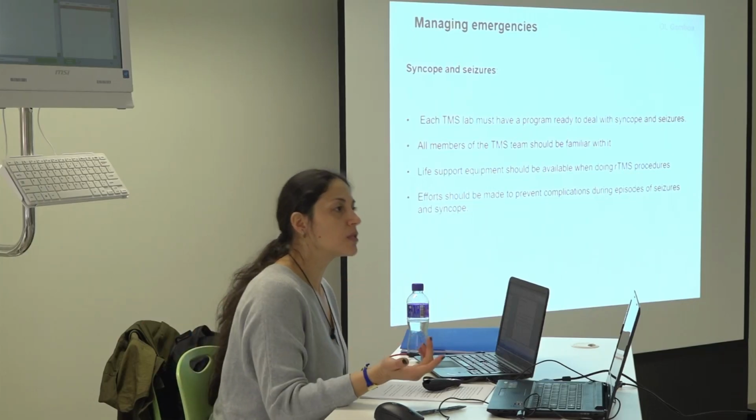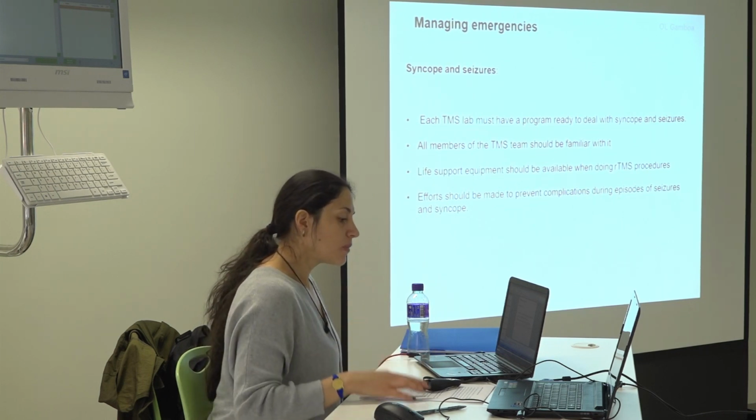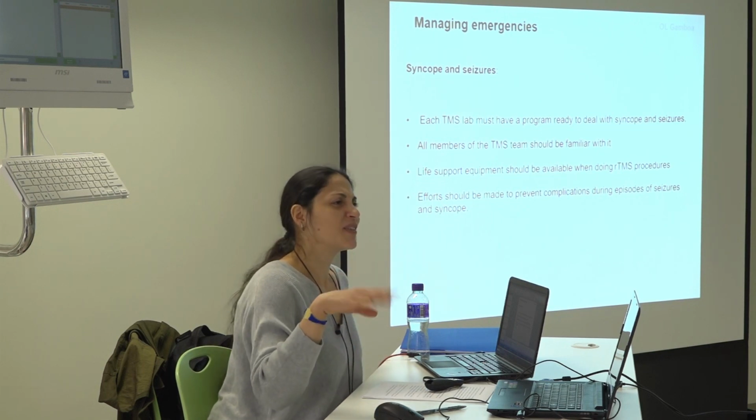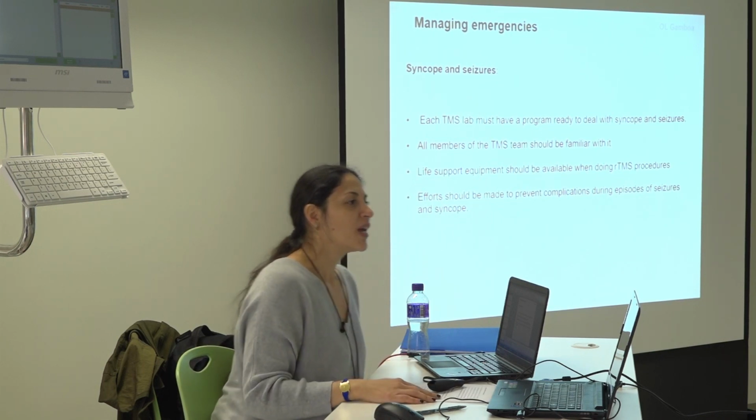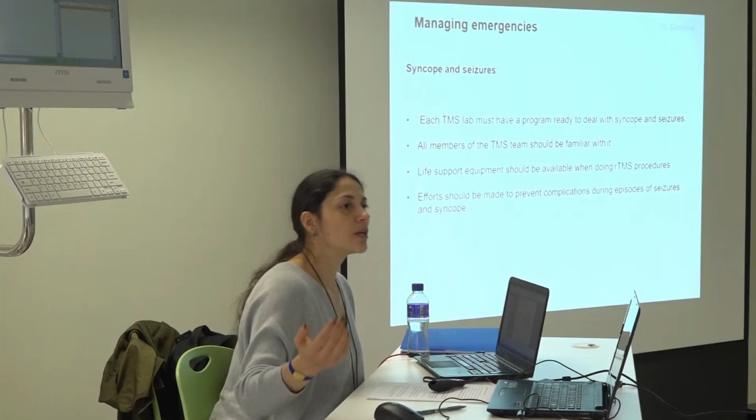I don't want to rush this part anyway because I think it's the most important part to start a TMS study. As I say, it should be compulsory that anyone who is coming to do a TMS study reads the consensus. It's really important. When I started TMS, well, it's going to be recorded, but it's just a silly experience I had. I had an accident on a motorbike, hit my head, and I was unconscious, and I was like 1 week under observation and all this kind of stuff.